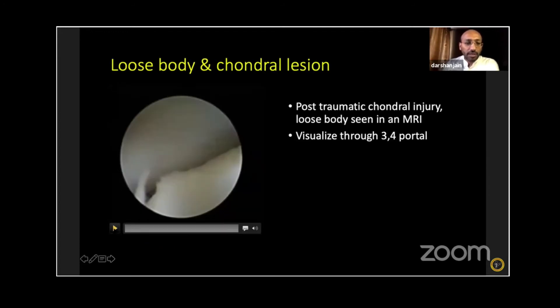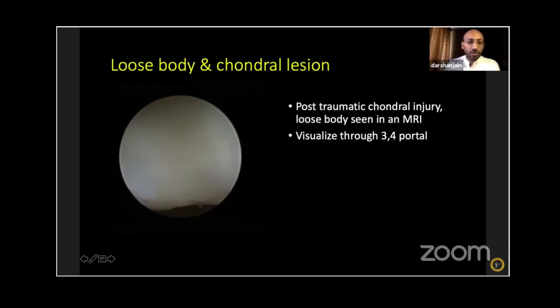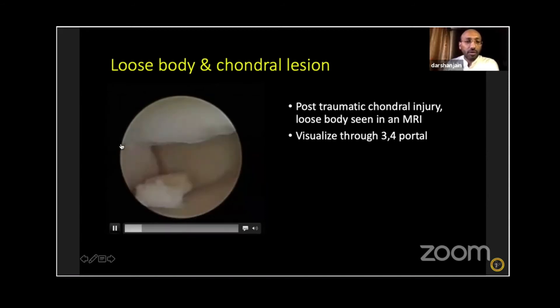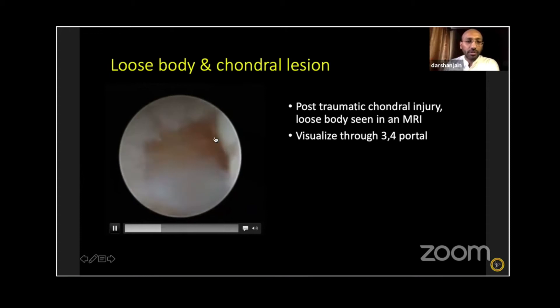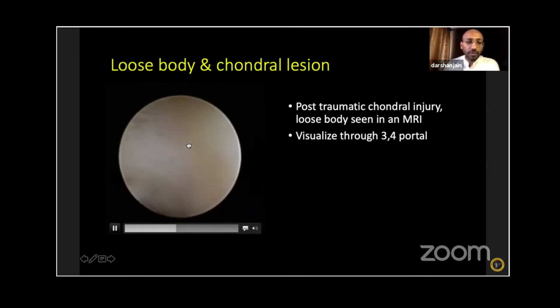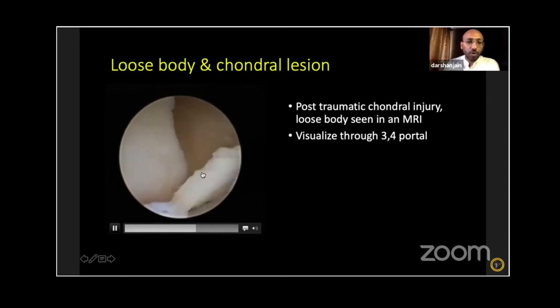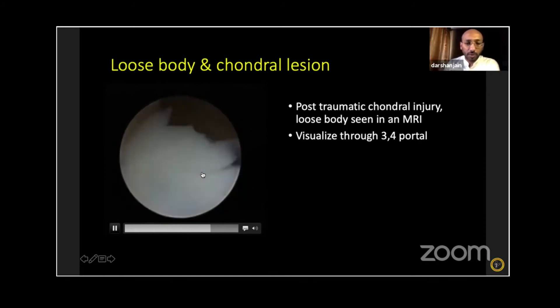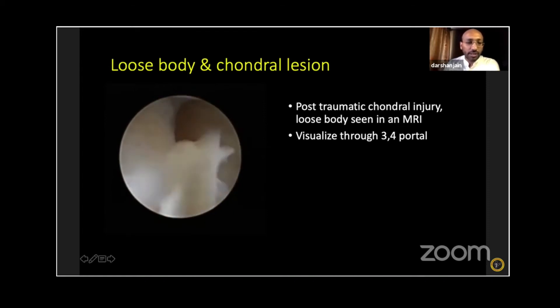Another indication is post-traumatic chondral injuries with loose bodies. We are visualizing through the 3-4 portal — that's the condition on the lunate. This is a loose body visible there, and this is the chondral lesion on the lunate. The loose body needs to be removed and can be taken out through the 6R portal.